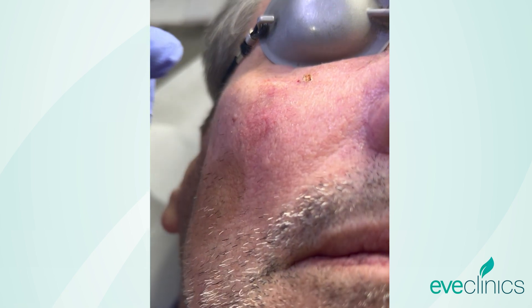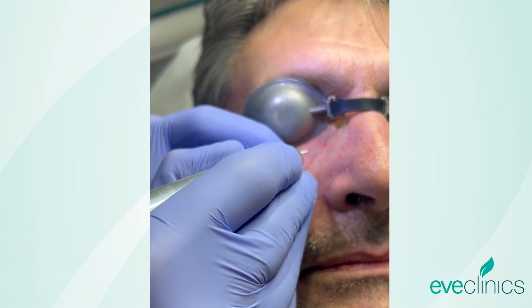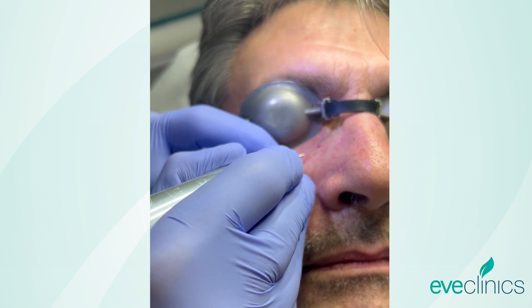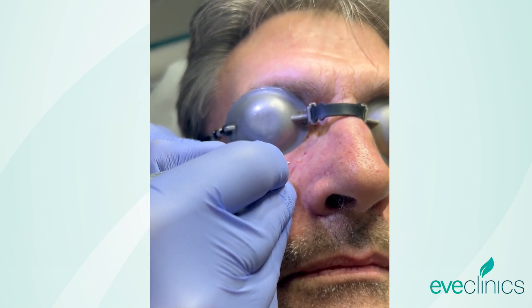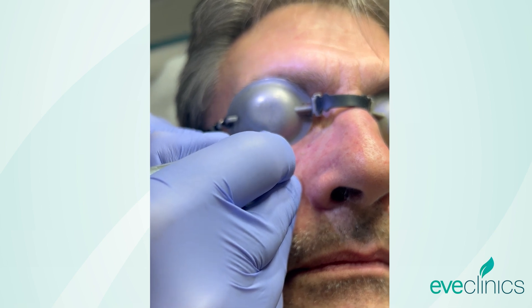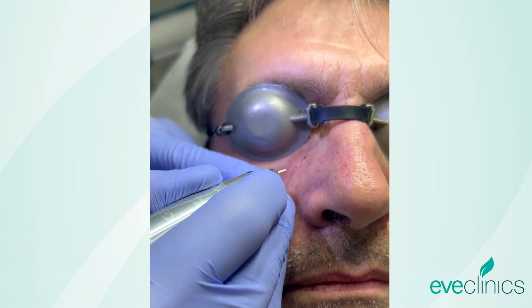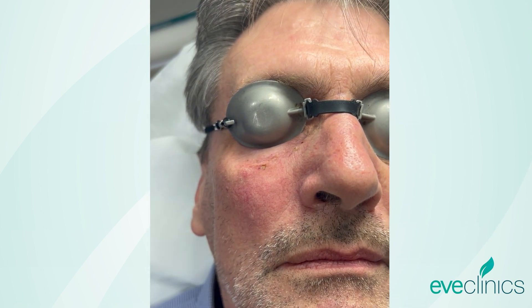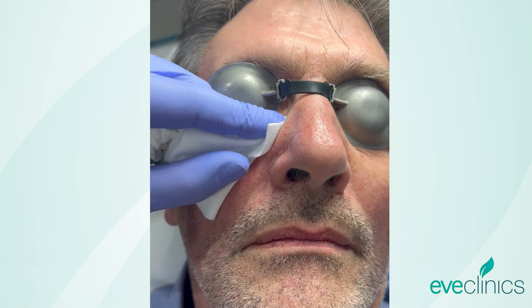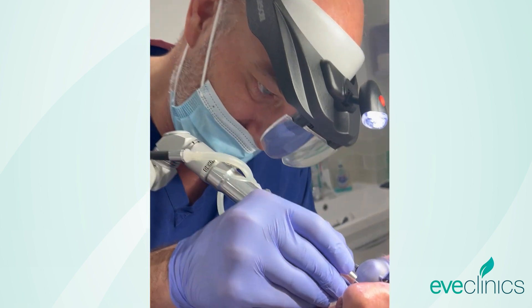That's one done. There's a lot of healing involved. Things that might get in the way of that, of course, are underlying health conditions like diabetes and the use of steroids for other health-related conditions. In most cases the healing is really very quick. And this is the last one here.